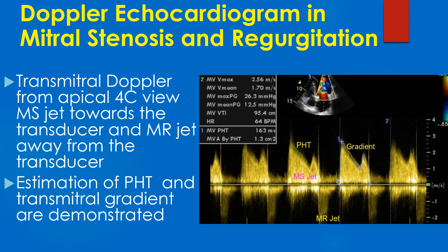Transmitral Doppler from the apical four-chamber view shows the jet of mitral stenosis towards the transducer and the mitral regurgitation jet away from the transducer, that is below the baseline. Estimation of pressure half-time and transmitral gradient are demonstrated.